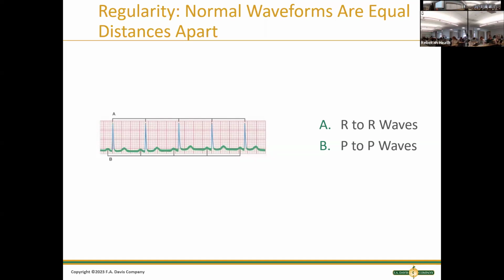Okay, as Raheem just so comically pointed out, we can look at it and tell it's not normal. But sometimes the rhythms are a little tricky, when they look fairly normal, but they're not. So if you are not absolutely sure, and if you're not well experienced with this, you might want to just go ahead and measure.